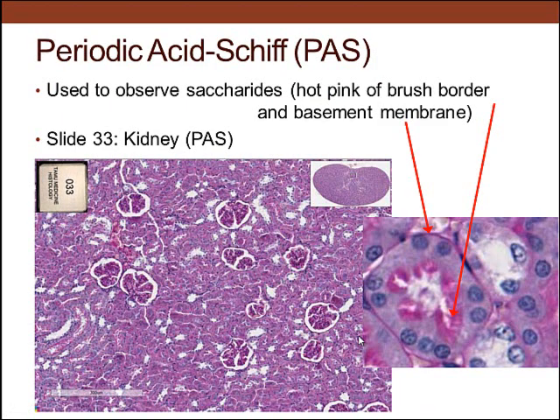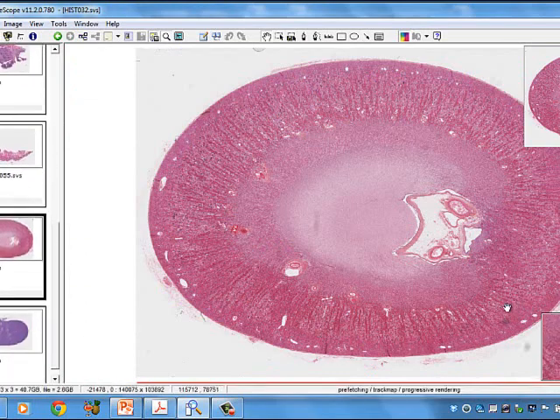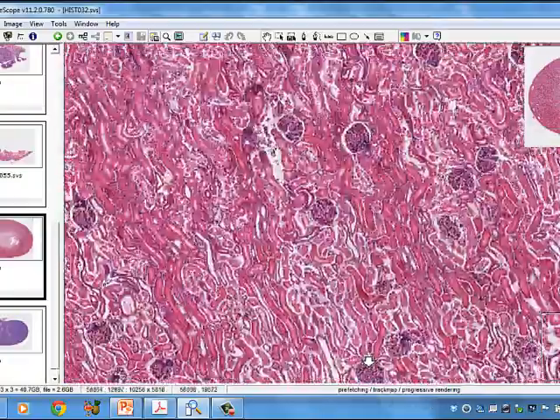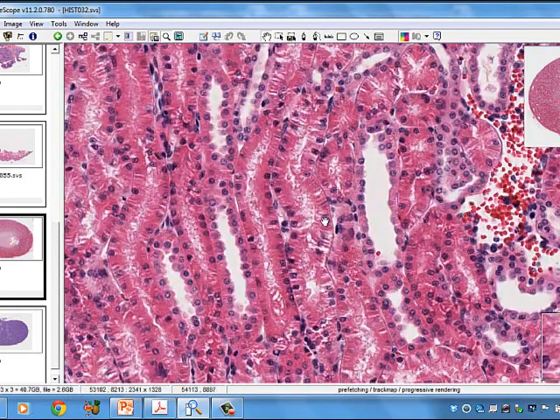And so, if we take a look at that specimen, we can see the cortex in through there, cortex from here to here, and then the medulla all the way there, and then finally urine is released into the pelvis and through there. And so if we look at a higher mag of the cortex, we can see the capsule surrounding the kidney, and then we can see a lot of tubules inside there.